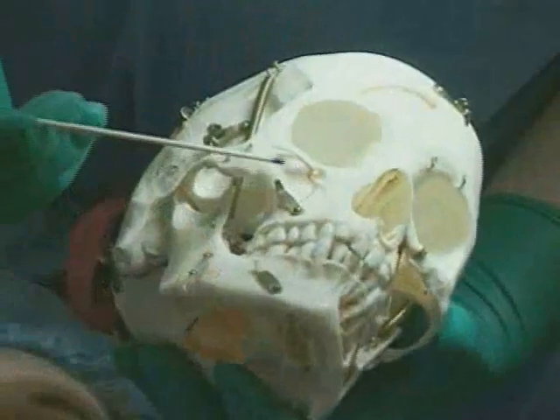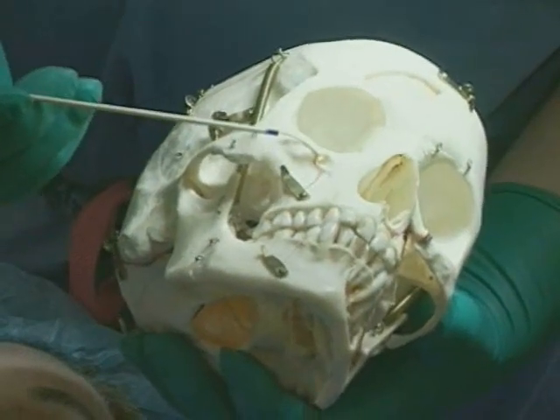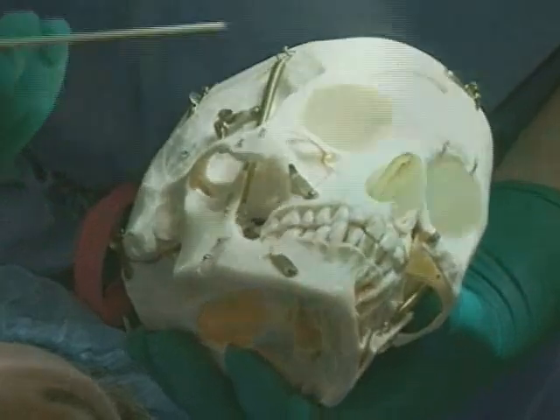One of the keys is we want to make sure that the implant does not ride above the zygoma or get above the orbital rim in this area because it could be palpated. We want to keep it mainly in this area and help to elevate these tissues, providing a nice contour.